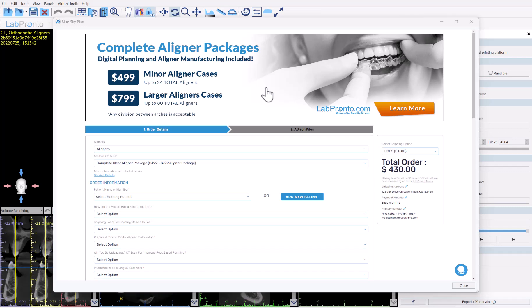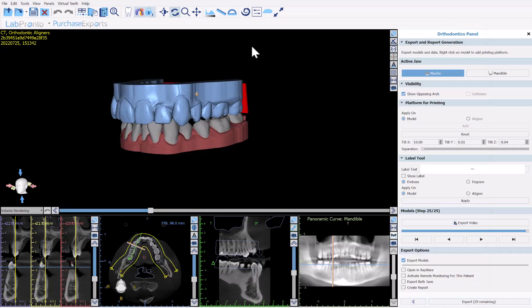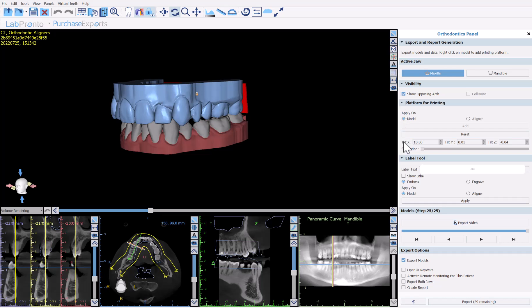Simply complete the information — your data has already been attached to the order form — then press the order button and your liners will be manufactured and sent to you. Now at the actual export stage, let's look at the panel. The top part shows the active jaw and the ability to show the opposing arch.